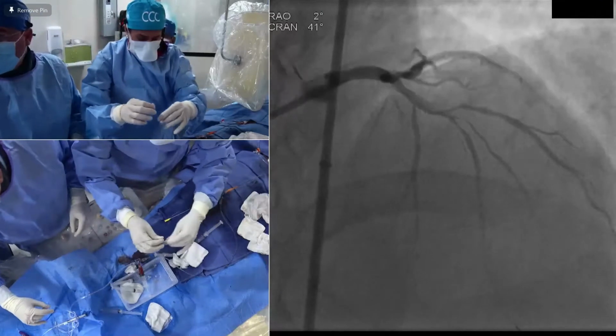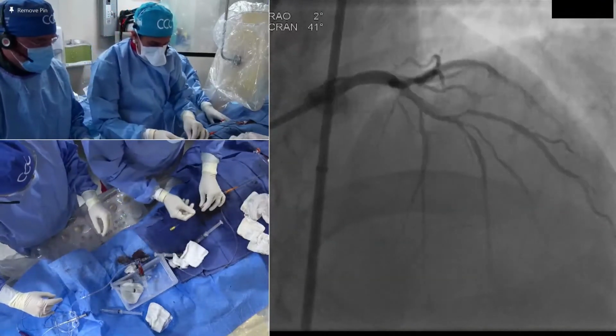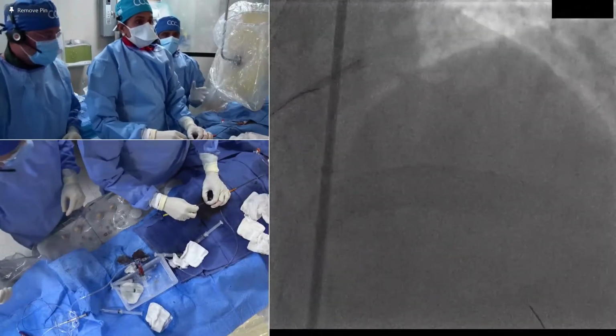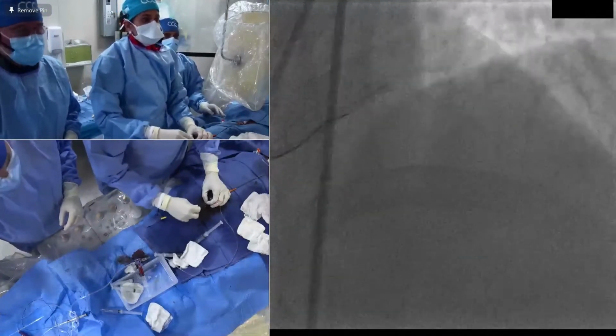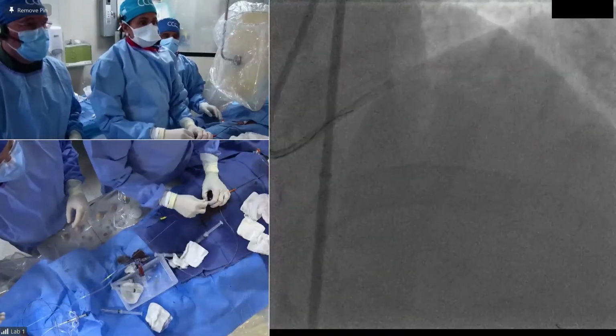300 run through. So this is what we are going to do now. Fine Cross, change to the 300 and dilate with a balloon. And then I know that we are on the time today. So in the next 2-3 minutes, we are going to end this case and you go to your very important revascularization guideline session. Yeah, and we'll update you.